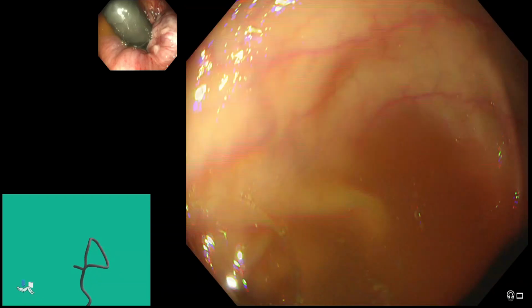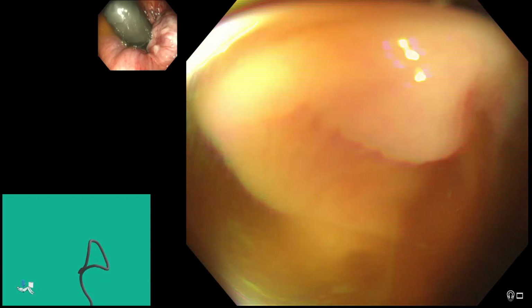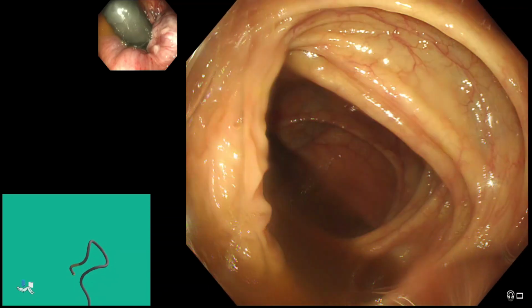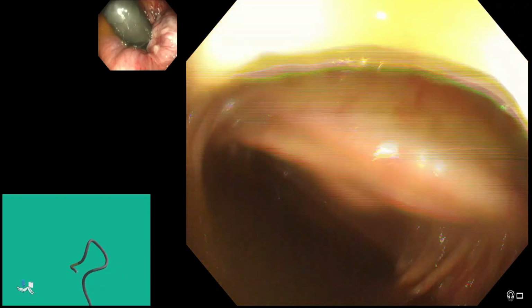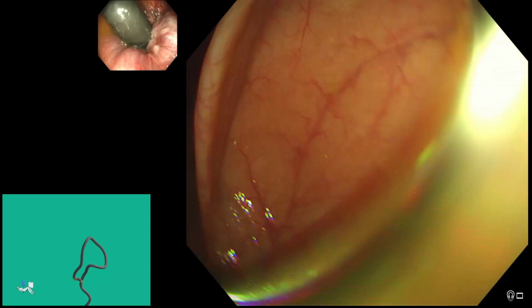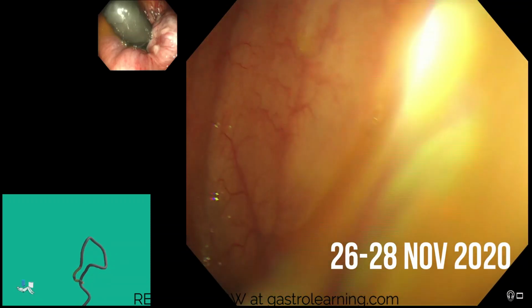And the patient's in the supine position at the moment. If I need to, and I have a very low threshold for going onto the left here, just to assist intubation of the ascending. Using a bit of tip control now, so I'm using big wheel to go up. We can see, hopefully that's the cecum in the distance there. Submerge, and again all I'm doing is sucking. And I think that's cecum there. Great. Thank you very much.